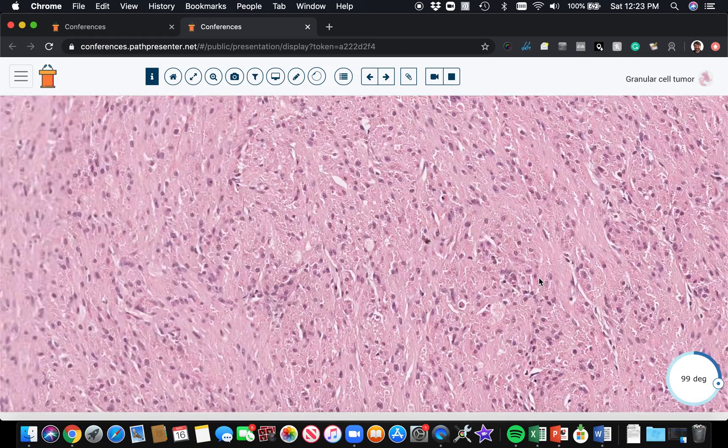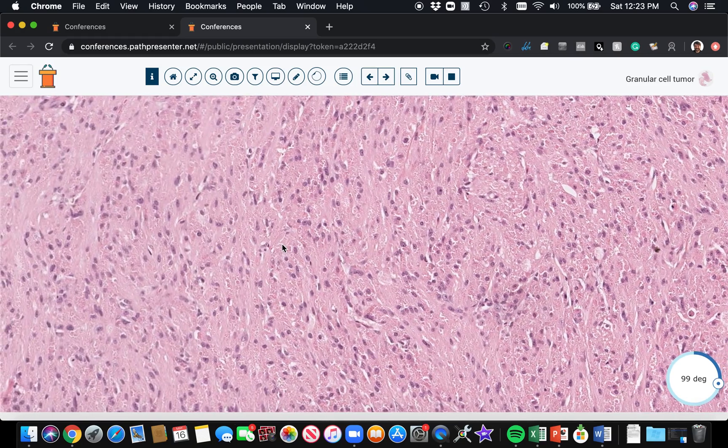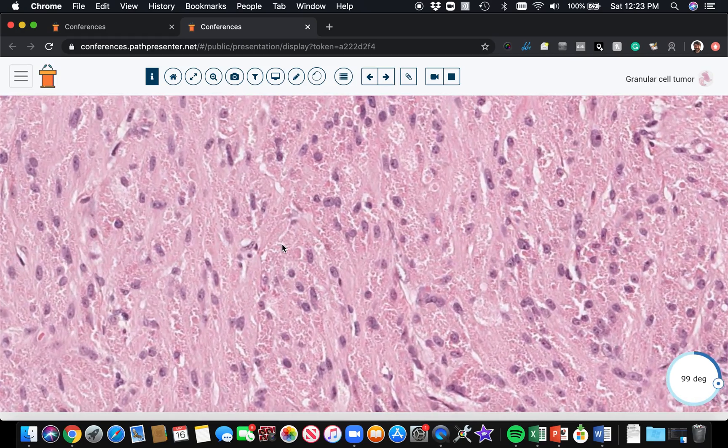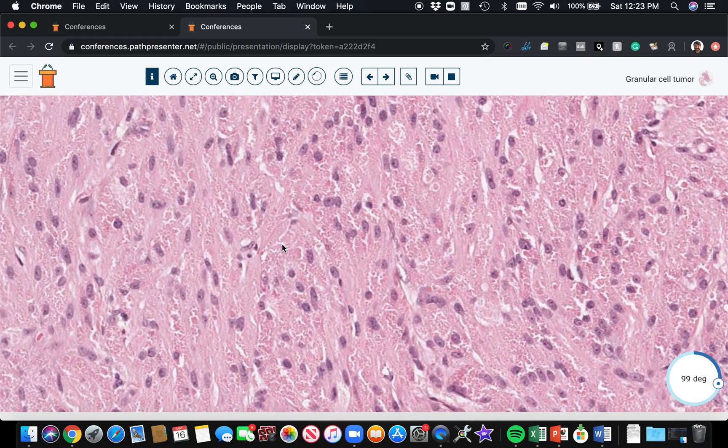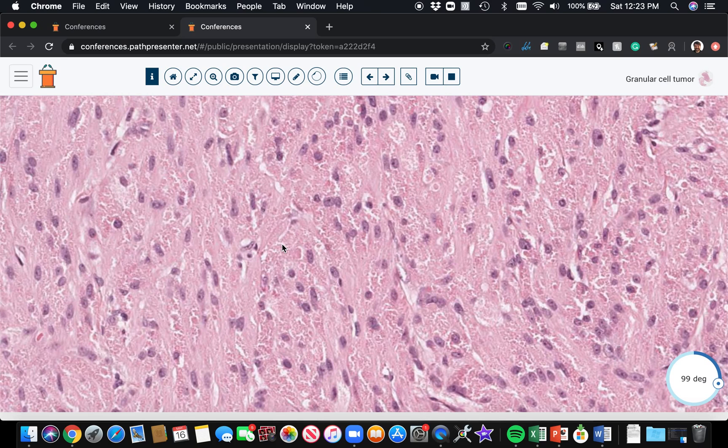The other thing to point out is the reason the cytoplasm is so granular is because these cells are loaded with phagolysosomes. And there's a marker, an immunostain marker, that stains phagolysosomes. That's CD68.